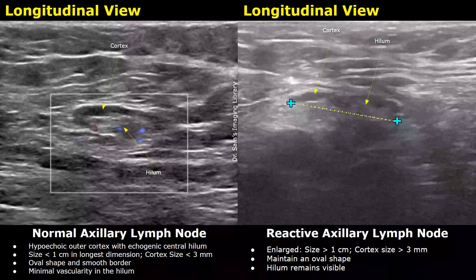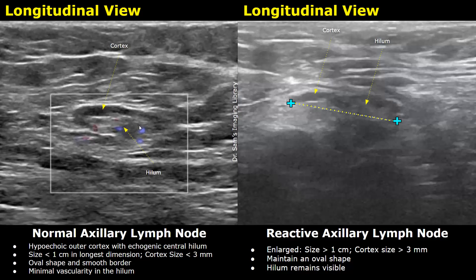Hello everyone, this is Dr. Sam and this video is about axillary lymph nodes ultrasound. A normal axillary lymph node has a hypoechoic outer cortex with an echogenic central hilum. This outer hypoechoic layer is the cortex, and the central fatty hilum will be echogenic.